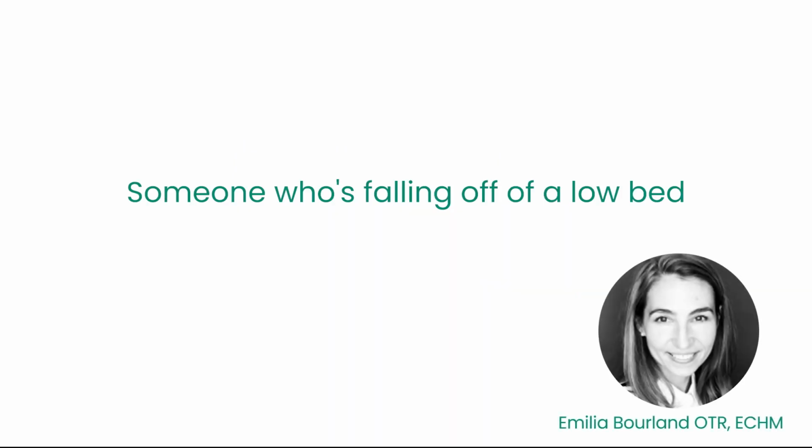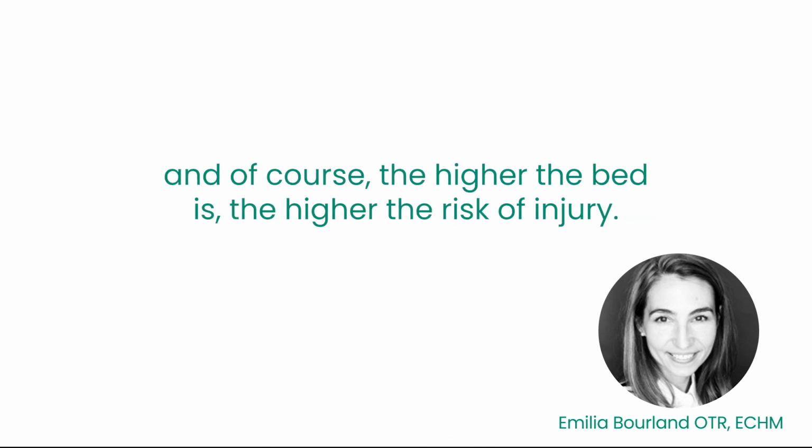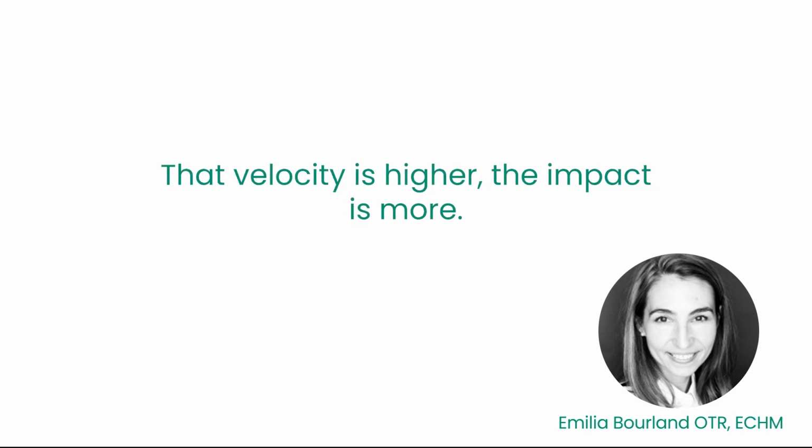Someone who's falling off of a low bed, that's still a fall, and there's still a significant risk of injury there. And of course, the higher the bed is, the higher the risk of injury. Again, this is just physics, right? That velocity gets higher, the impact is more.